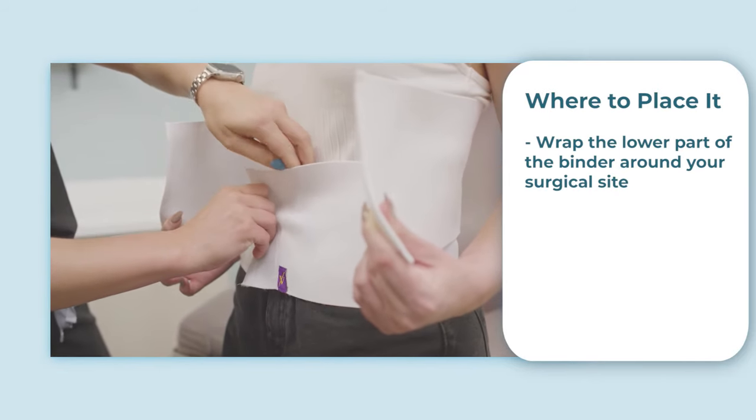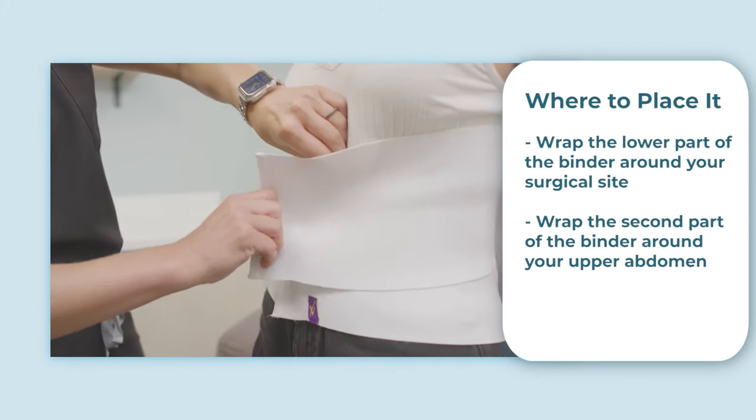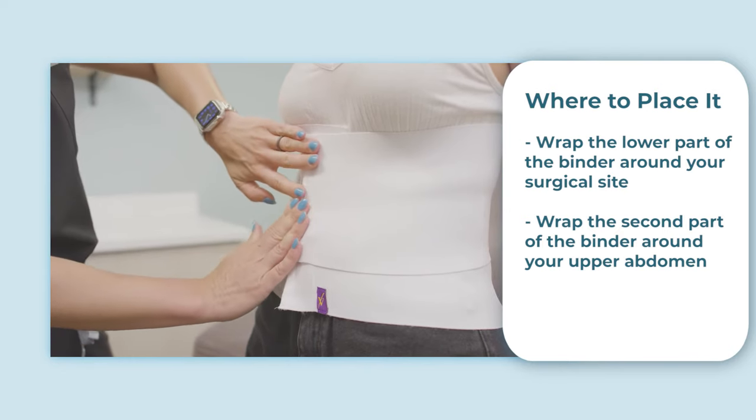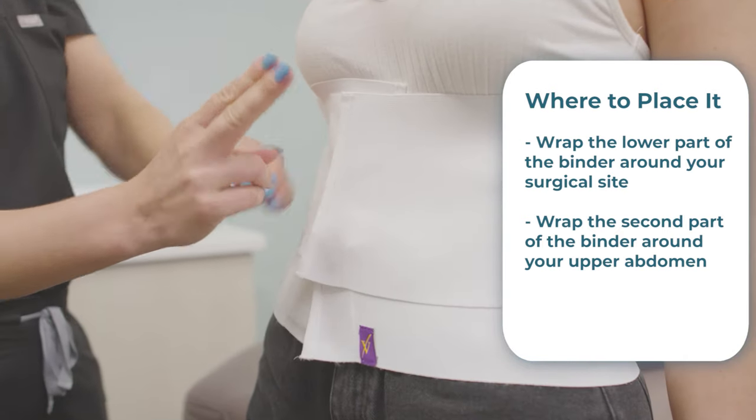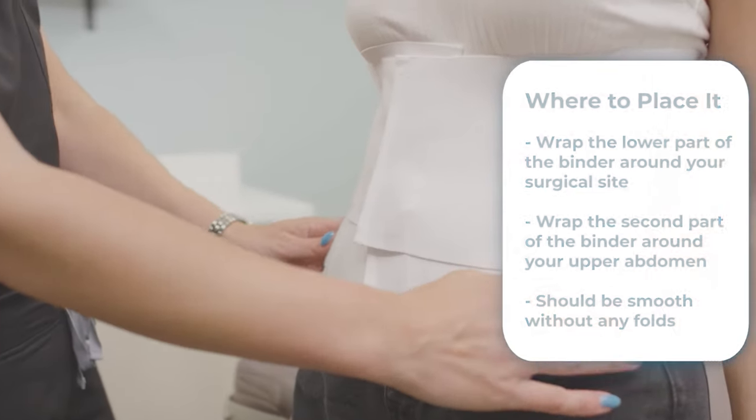Make sure your incision site is fully covered by the binder. Next, wrap the second part of the binder from back to front around your upper abdomen, resting just below the breasts, and then fasten it in place. Your entire abdomen and surgical site should now be covered, and the binder should be smooth without any folds.